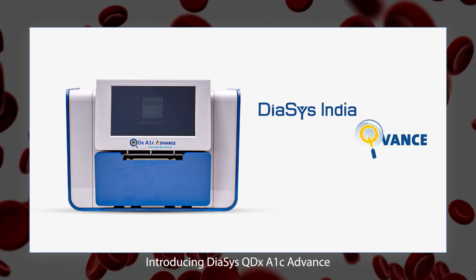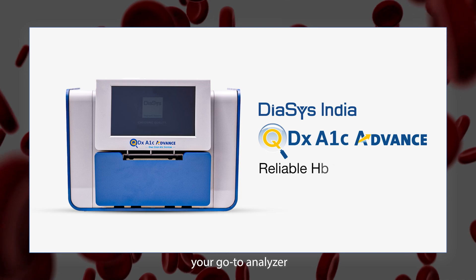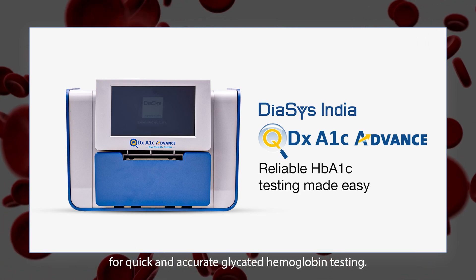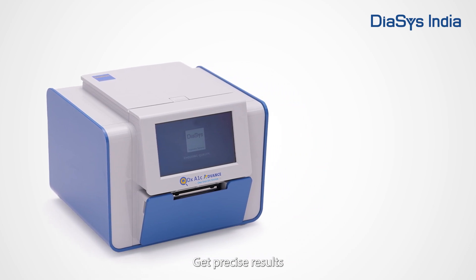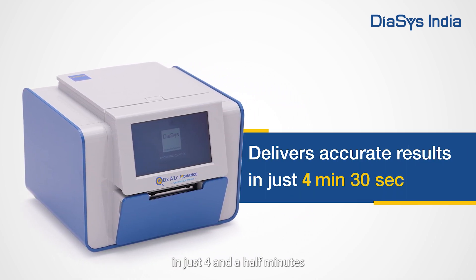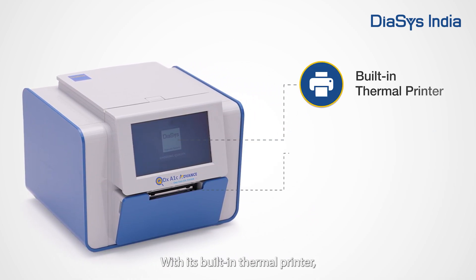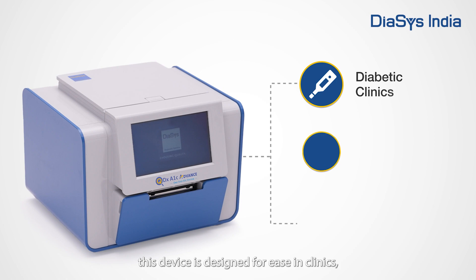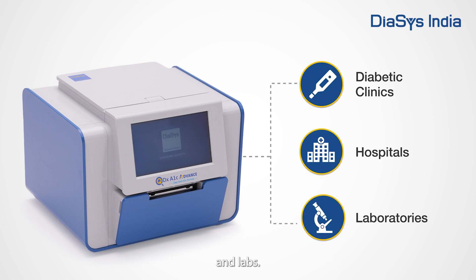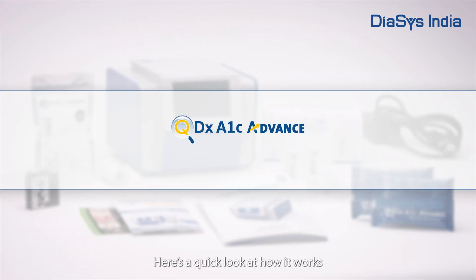Introducing DICE's QDX A1C Advance, your go-to analyzer for quick and accurate glycated haemoglobin testing. Get precise results in just four and a half minutes. With its built-in thermal printer, touchscreen, and audio guide, this device is designed for ease in clinics, hospitals, and labs. Here's a quick look at how it works.